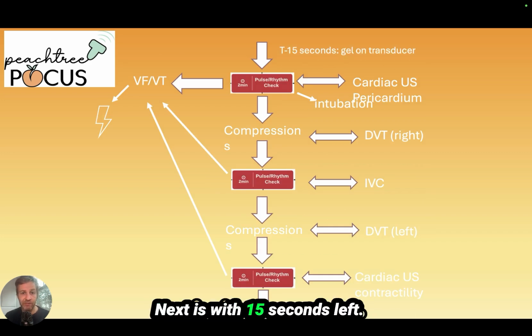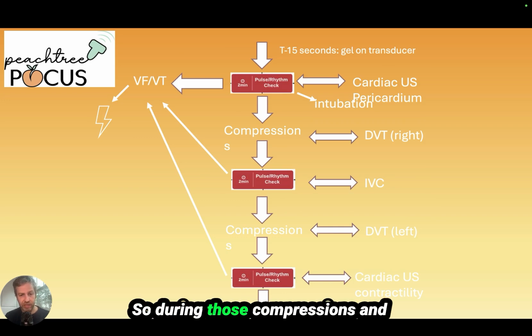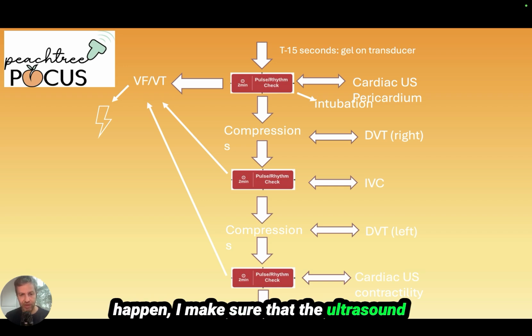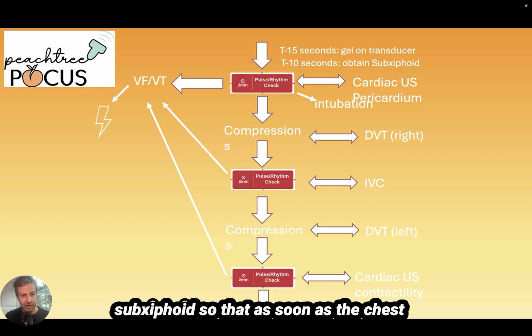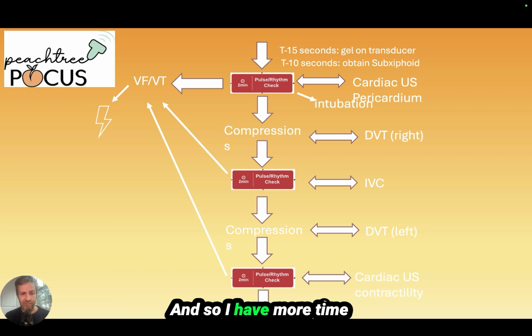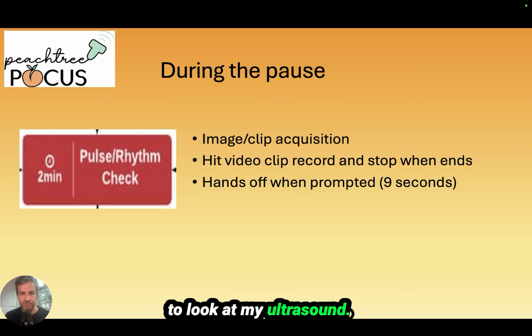Next is with 15 seconds left. Even just before that, I'm making sure gel is on the transducer. So during those compressions and right before the pulse check is going to happen, I make sure that the ultrasound is ready to go. And then I'm getting my subxiphoid view so that as soon as the chest compressions stop, I'm not wasting time getting the view. I essentially already have the view ready to go. And so I have more time to look at my ultrasound.